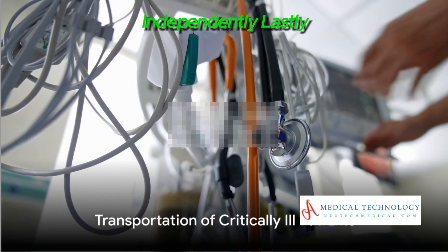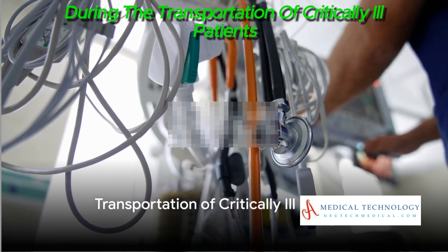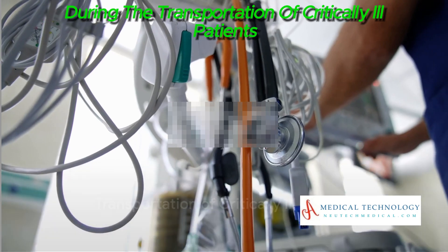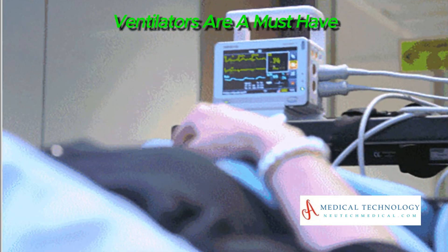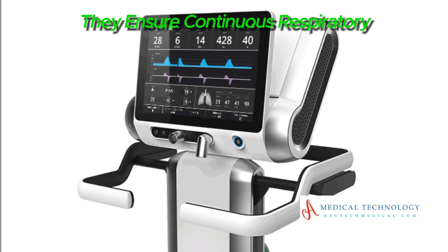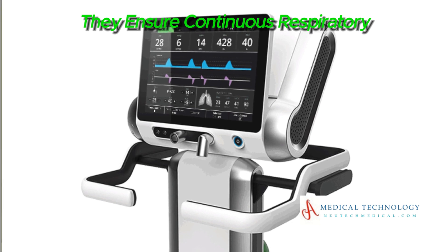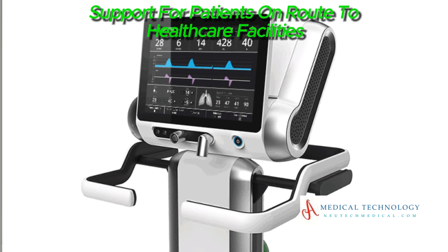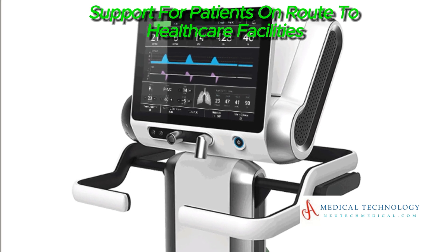Lastly, during the transportation of critically ill patients, ventilators are a must-have. They ensure continuous respiratory support for patients en route to healthcare facilities.